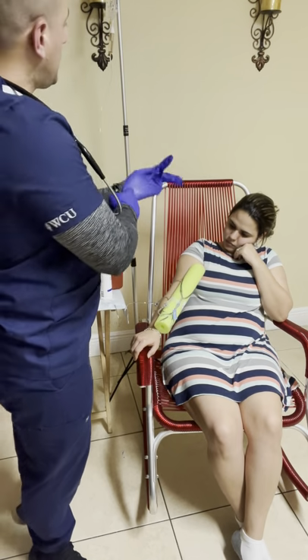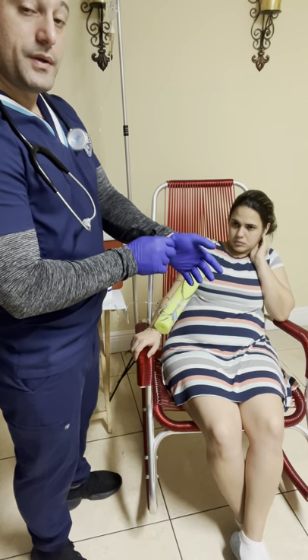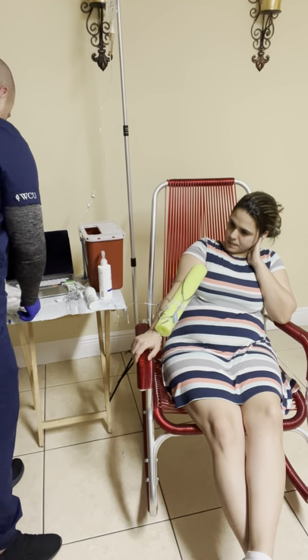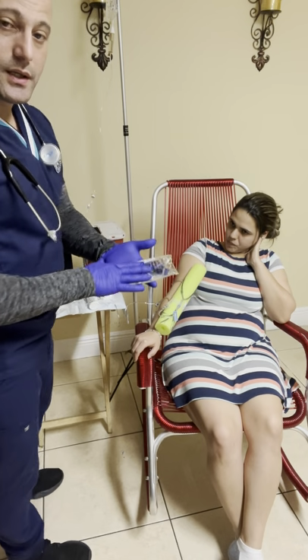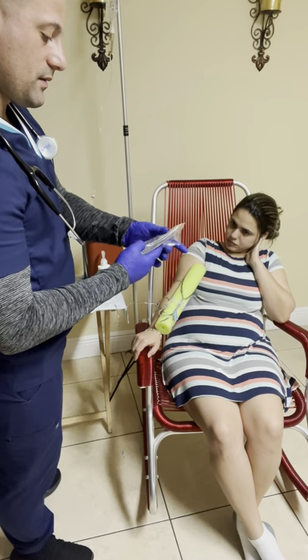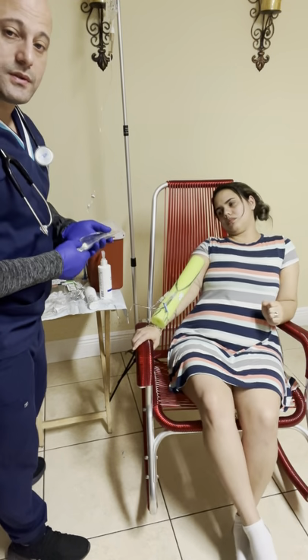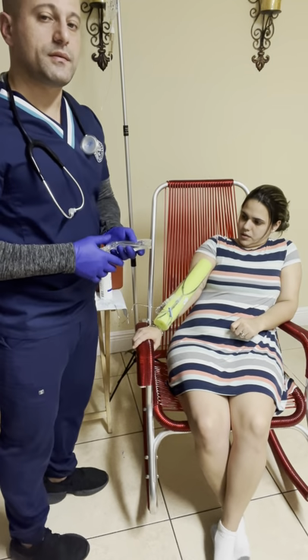The patient has a primary IV bag. I'm going to use a small or piggyback bag with the medication, in this case amikacin for the urinary infection. In the EMR, I'm going to check the medication that was previously prepared in this small 50 mL IV bag. I'm going to check if this is the correct medication, the correct patient, the correct route, the correct frequency.